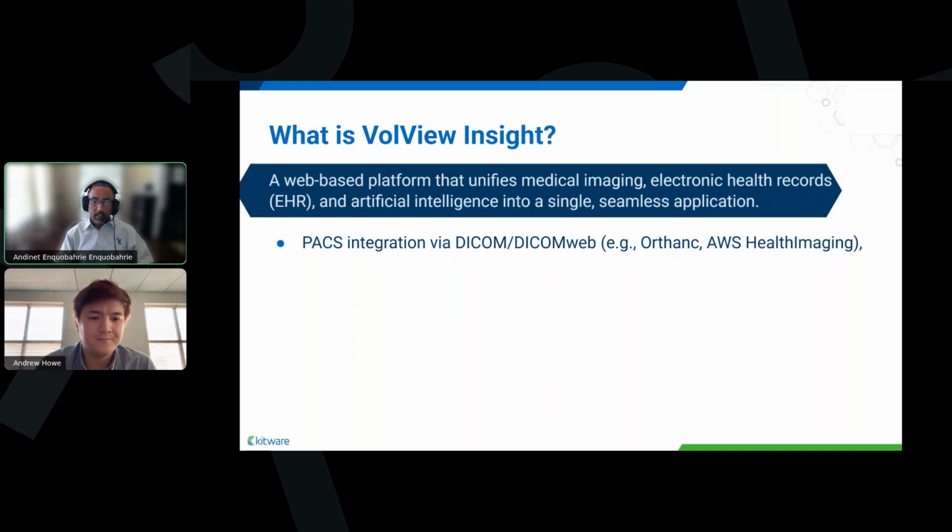So whether you're using the open source DICOM server Orthanc, and that's what Andrew will be demonstrating today, or any other cloud services like Amazon AWS HealthImaging DICOM store, you can directly connect your imaging studies into the workflow instantly. So you have that DICOMweb interface.